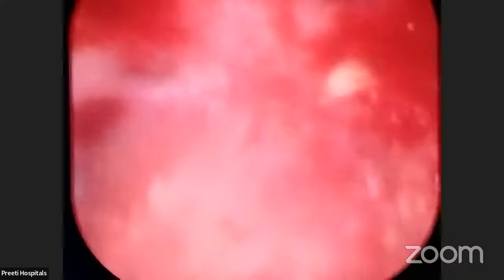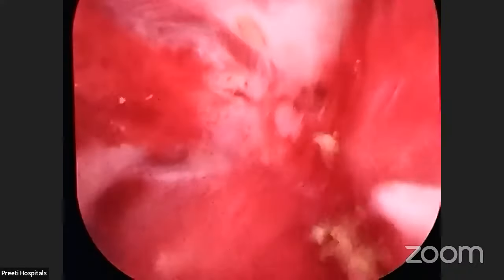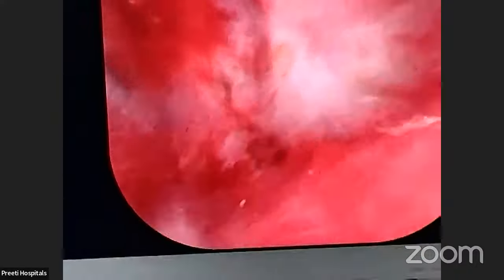Let's say, Pulsar asks how many such fragments will come out. Same as in PCNL, the volume is to be considered when they come out, not the diameter. See, can you see the entire calyx, any damage? Nothing. Just a few are there, that also I don't want to leave. Tomorrow if the CT is done, absolutely there should not be any stone.